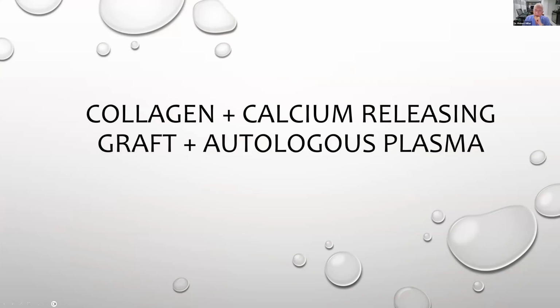The vast majority of the implant cases that you're going to be doing is extraction and grafting, or extraction, grafting, and immediate implant placement. So I want you to take the few concepts I just gave you, and now we're going to apply this to an extraction site because I call this my trifecta. What I mean is I have three different materials.